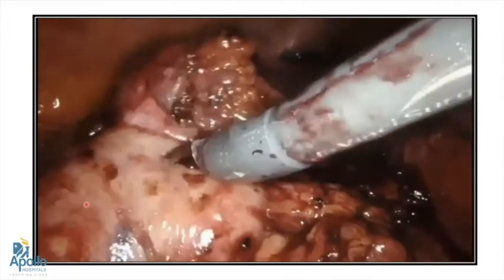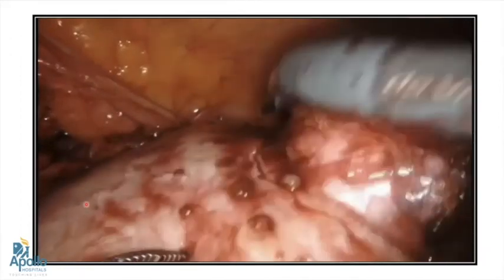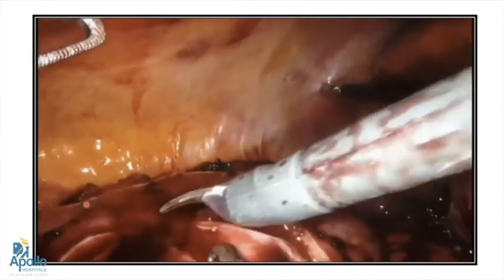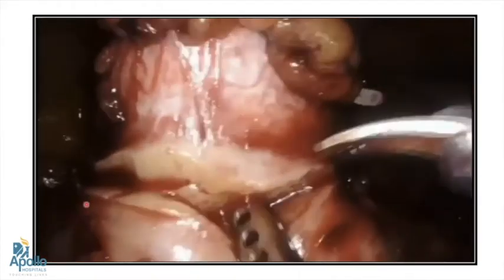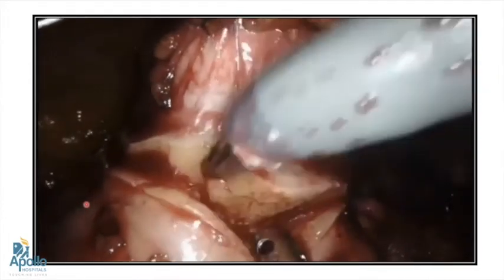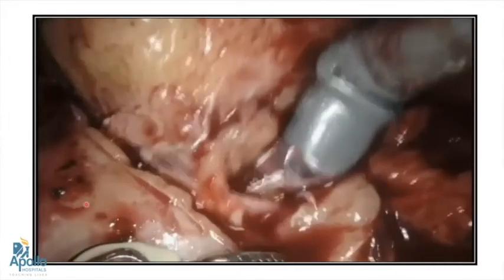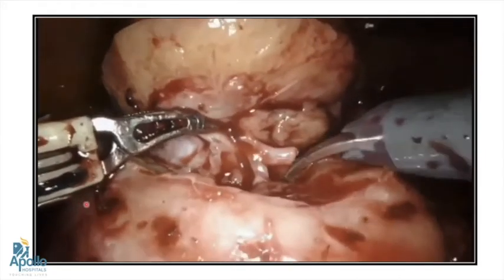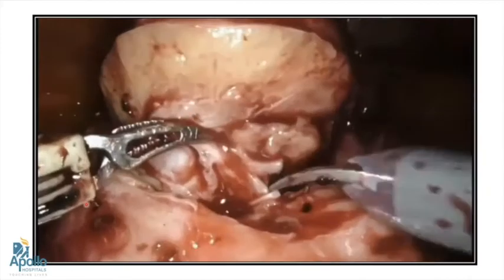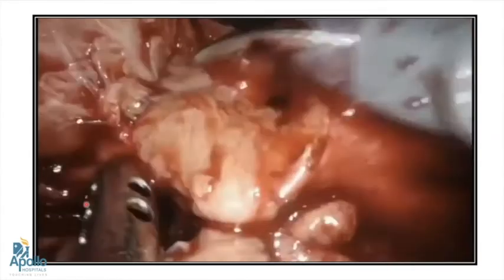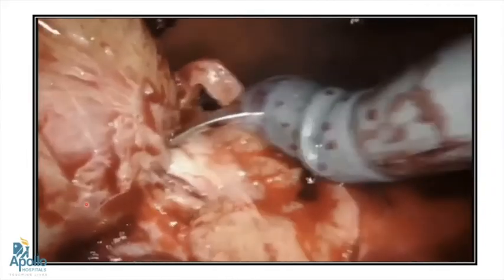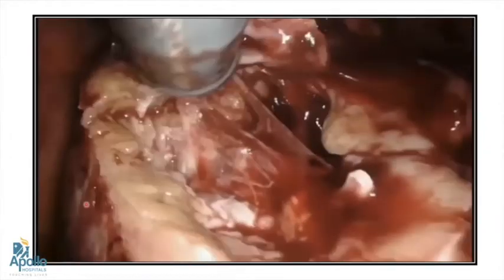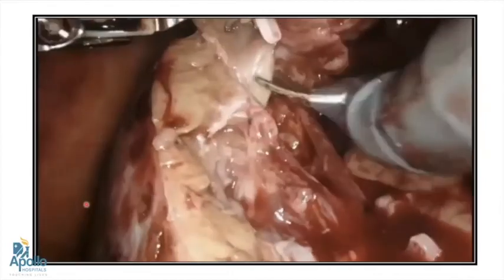Since the tumor lies very close to the hilum, both artery and vein are clamped. The tumor is resected using sharp cuts with a circumferential incision all around, with the left hand lifting the tumor. The assistant plays a very important role in keeping the field clean by continuously suctioning blood. Any small vessels entering the tumor can be individually clipped with Hem-o-lok clips and cut. Traction and visual cues are very important.